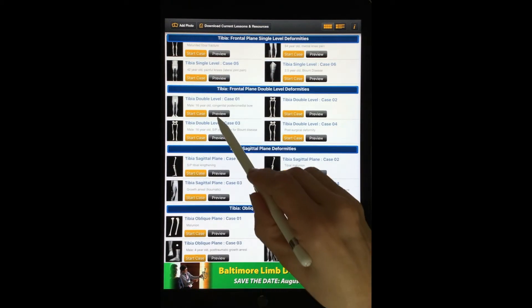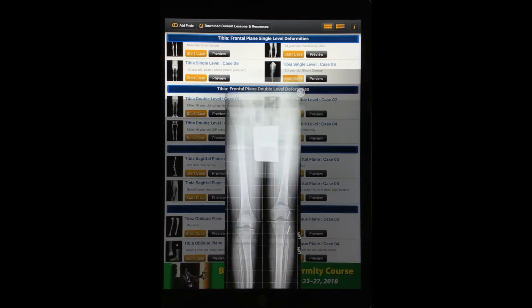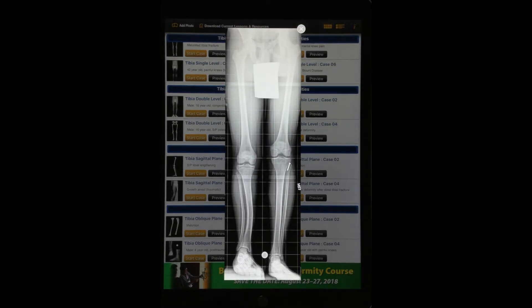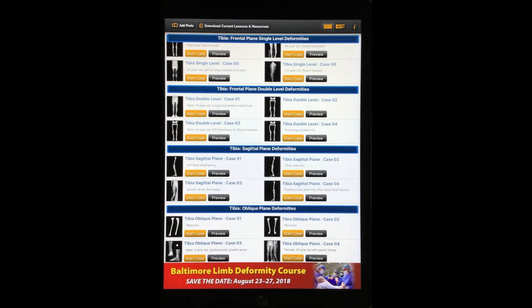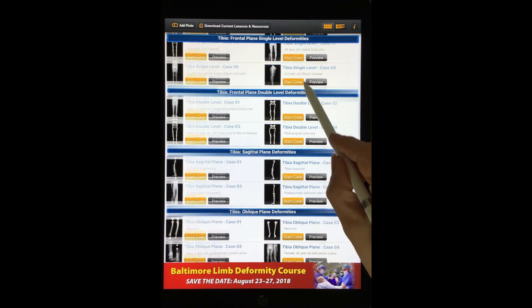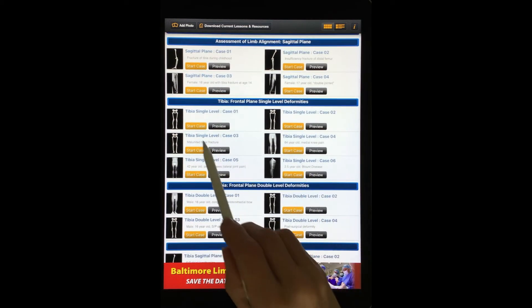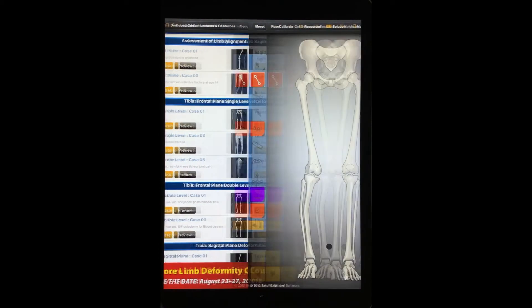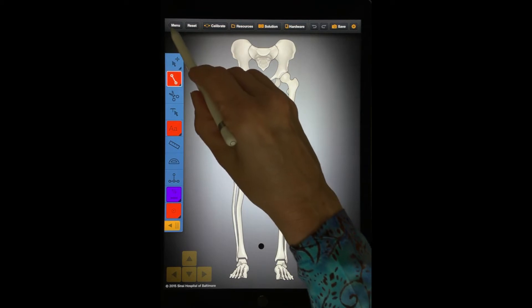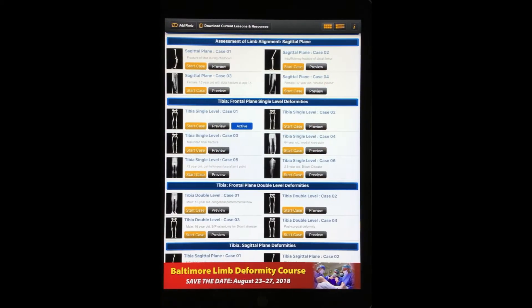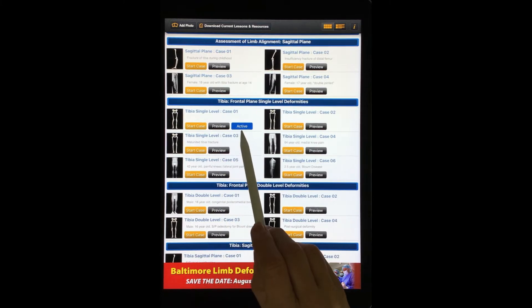To preview a case, select the Preview button. Close the preview by selecting the X. To open a pre-loaded case, select Start Case. Press the Menu button to return to the main menu. When you return to the main menu, you see that the case now displays as Active.